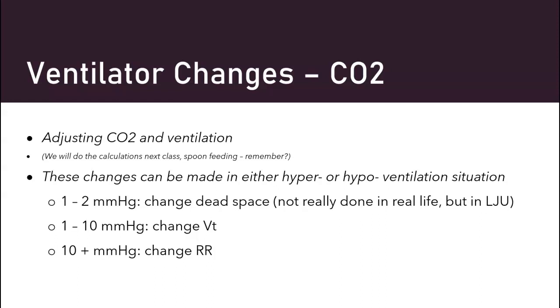My tidal volume, they're my little bites. Whereas respiratory rate, this would be if I need to make changes for hyper or hypoventilation of 10 or greater, above or below. So these are my big bites in my CO2 changes.